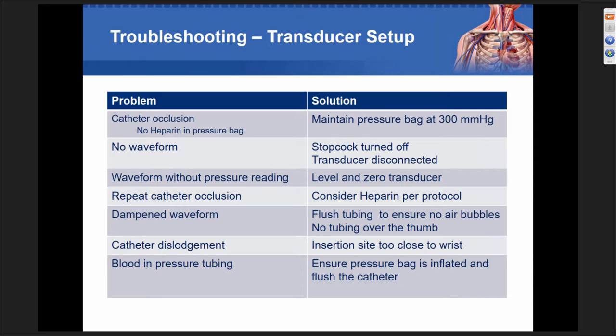It feels like you have flip-flops on, between your thumb, between your big toe and your middle toe, and they are annoyed by that feeling. So all they do is continue to play with their wrist, and that dislodges the catheter. So we really have to be simple in our mindset of where we put the tubing and how we dress the catheter.